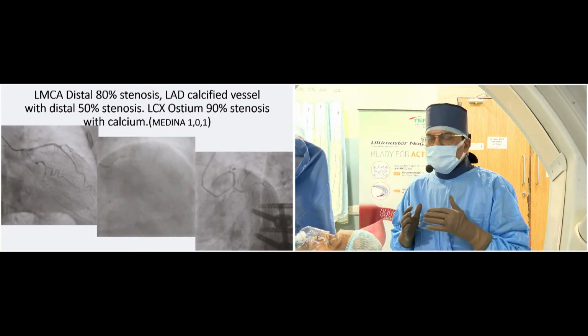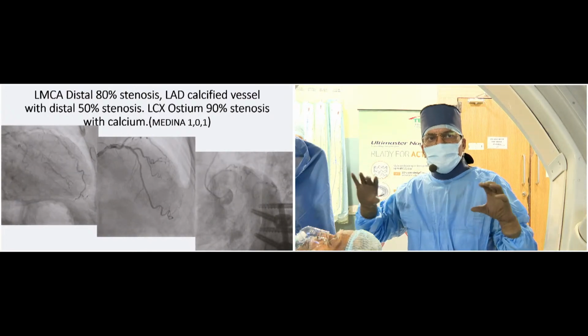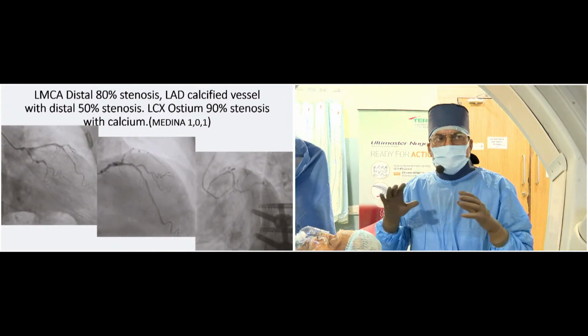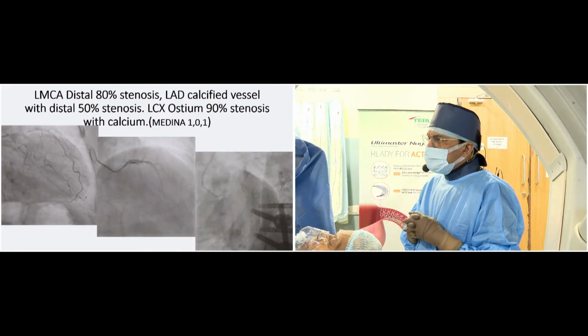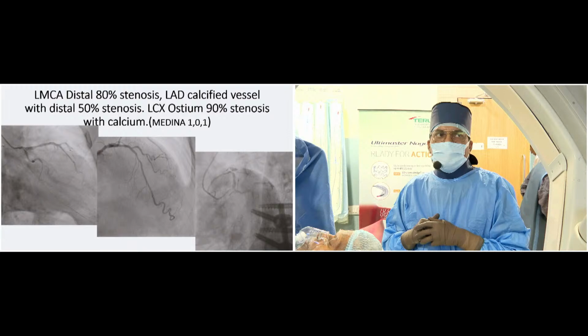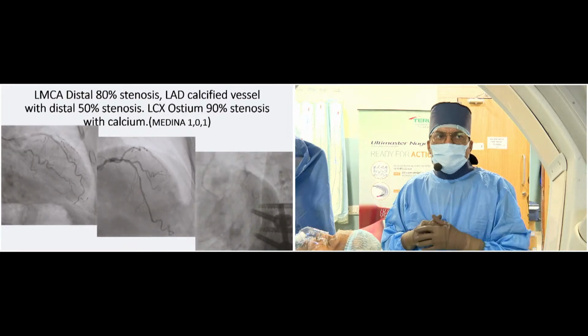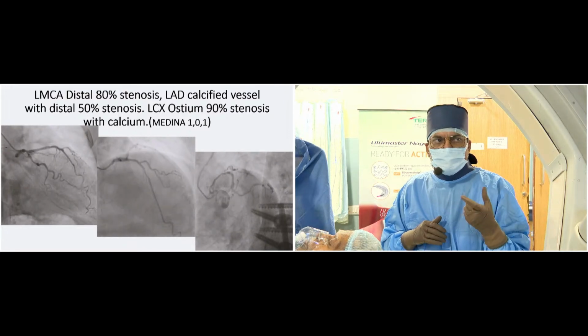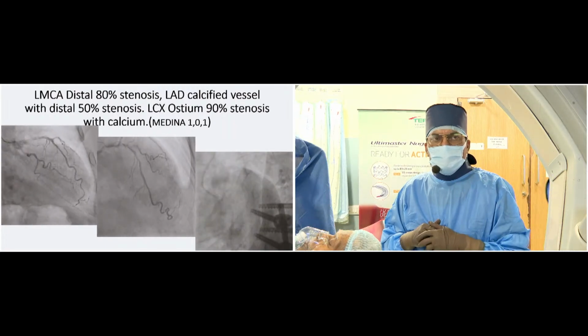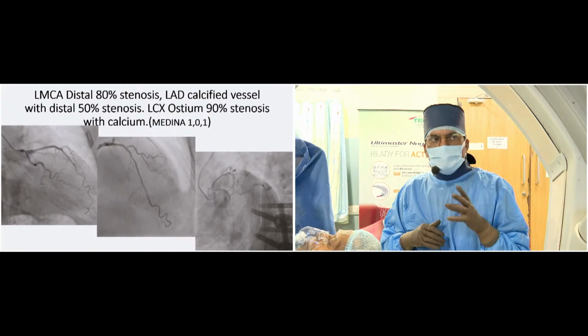If you see the bench stents also, it becomes flat, the even struts and the whole configuration will be lost. There is also a chance of polymer coating problems, disruptions in the polymer, and stent fracture may be more. So that is the reason this design definitely helps, particularly when the large size is there.